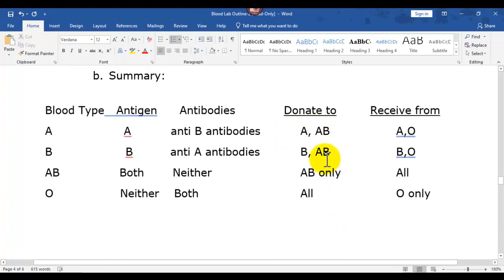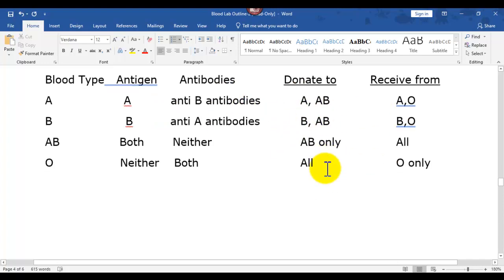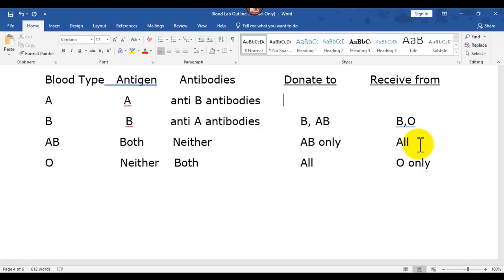Now, on your lab exam, we're going to do it this way. If you do this, you get full credit. If you put the pluses and the minuses in the right places, I'll give you some extra points. So the reason we don't do this, and I'm figuring my textbook doesn't do this, so I'm going to erase what we just did up here. Let's say we're going to be super technical, and we're going to add the negatives and the positives.